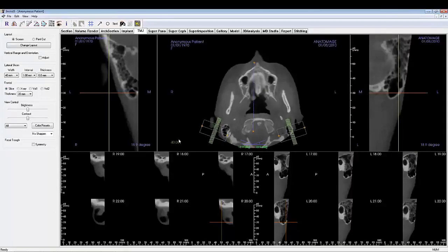This is a TMJ tab tutorial used to examine a patient's temporal mandibular joint, useful in diagnosing TMJ disorders or planning TMJ-related treatments.